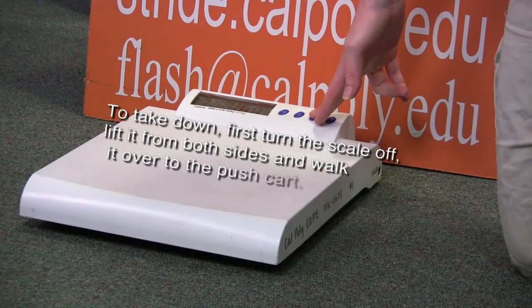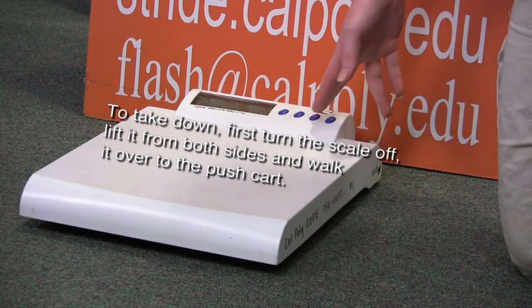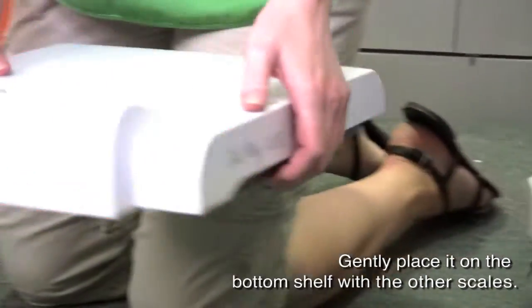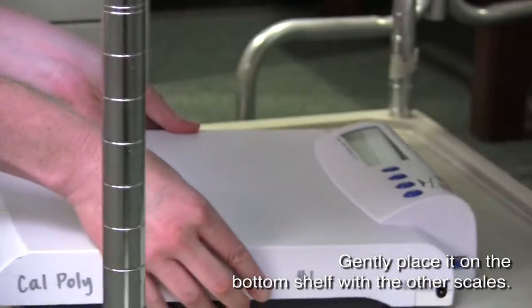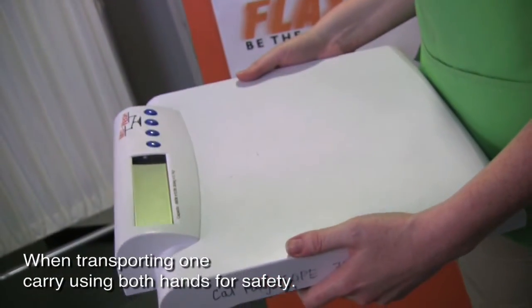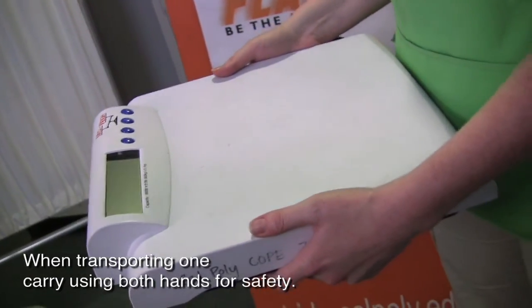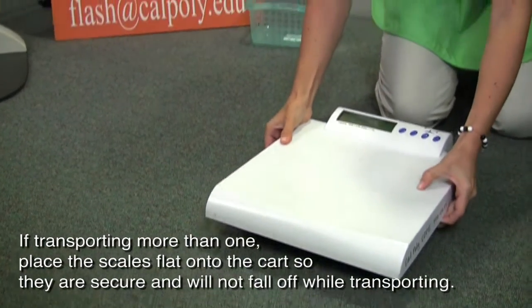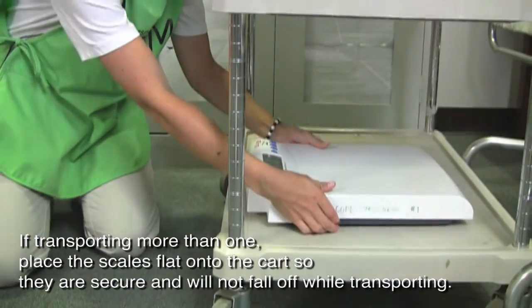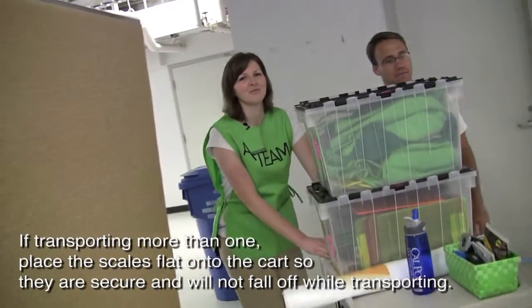To take down, first turn off the scale and lift it from both sides and walk it over to the push cart. Gently place it on the bottom shelf with the other scales. When transporting one, always carry using both hands for safety. If transporting more than one, place the scales flat onto the cart so they are secure and will not fall off during movement.